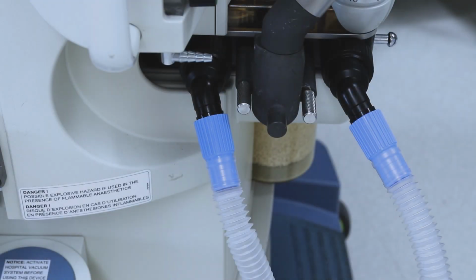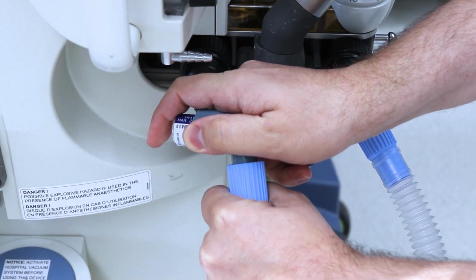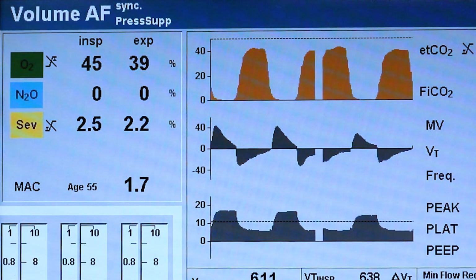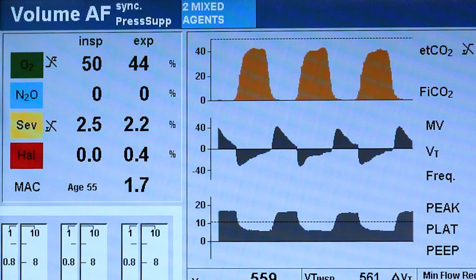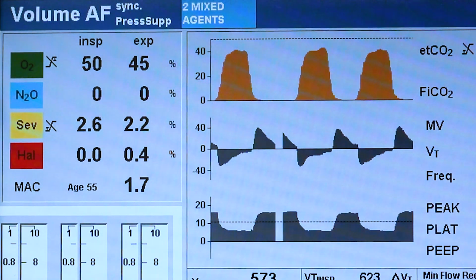Now here's the scenario of interest. You administer intraoperative albuterol via the inspiratory limb of the breathing circuit or directly via endotracheal tube. You then see an abrupt increase in MAC value, followed by the appearance of halothane. Considering there hasn't been a bottle of halothane in your hospital for 20 years, what's actually being detected?